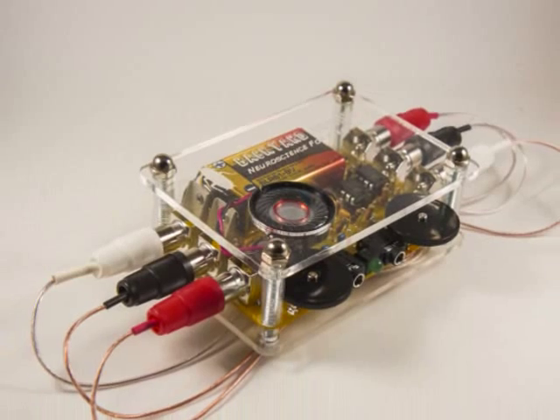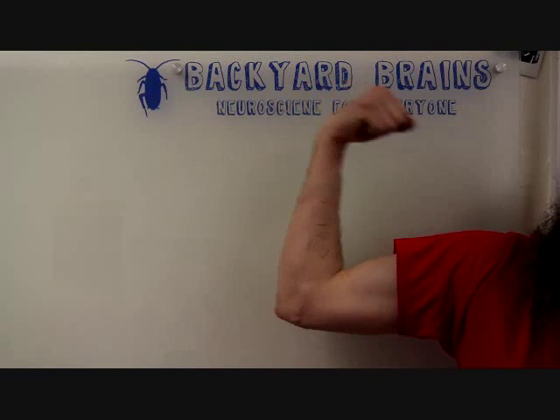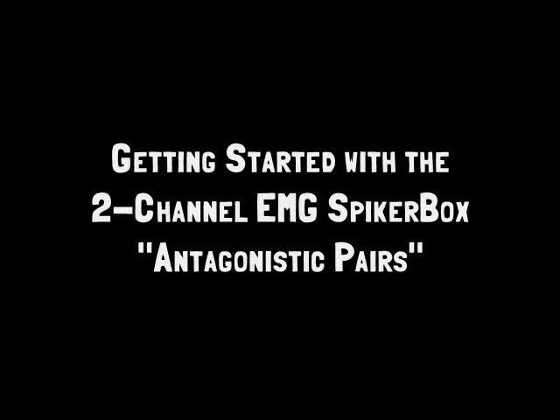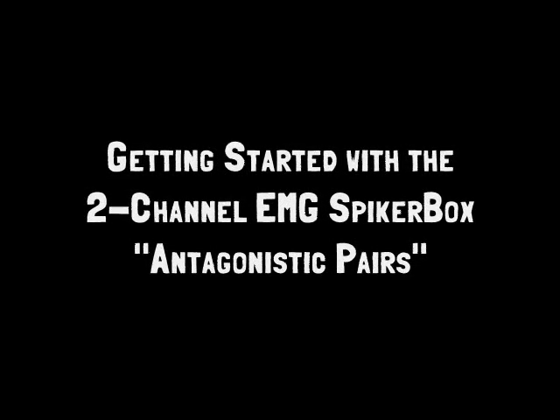But now, with the 2-channel EMG Spiker Box, you can record the electrical activity of two muscles at once — not just one, but two! Once you have your 2-channel EMG Spiker Box, where do you start? Head to backyardbrains.com and open up the Getting Started with the 2-channel EMG Spiker Box experiment.